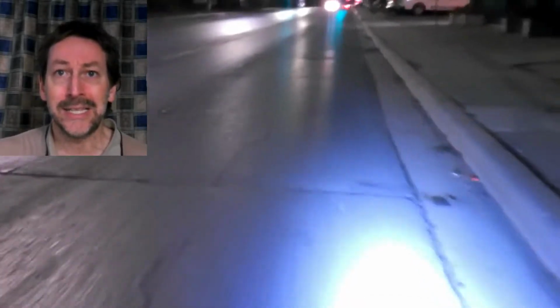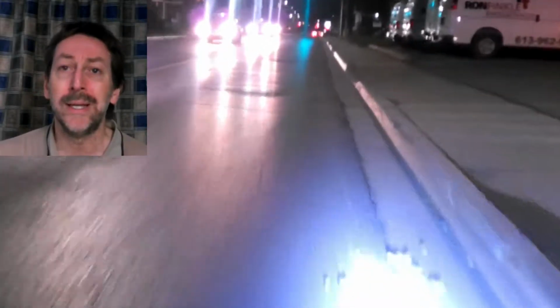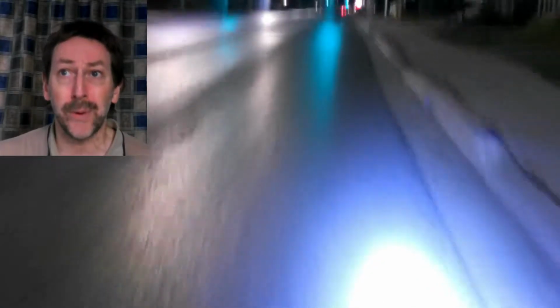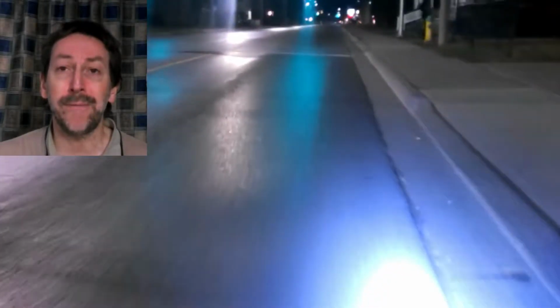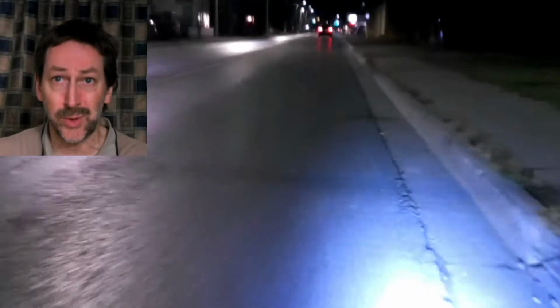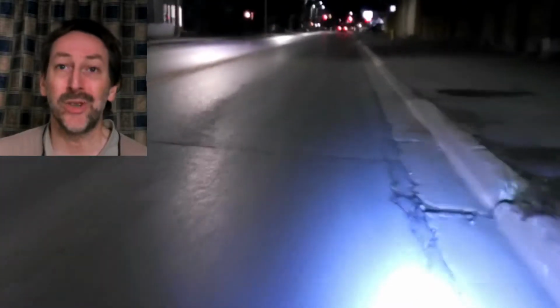The reality is that I use the white LED light for about 23 minutes on the way to the gym and another 23 minutes on the way home. So it means I'm using about 9 watts worth of electricity out of the battery. I have a 12 volt 2 amp charger for the battery. About 45 minutes of it being on is more than enough to recharge the battery. So it doesn't use a lot of energy. Even with 14 watts being drained, there's still lots of capacity in the battery to run other wheelchair accessories.